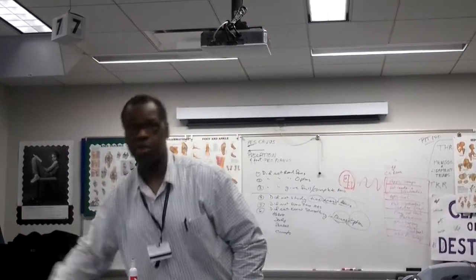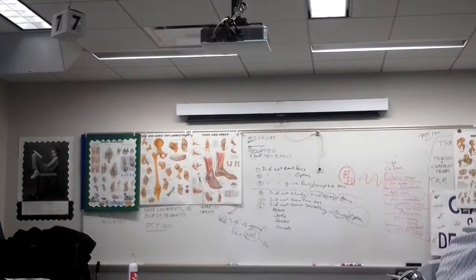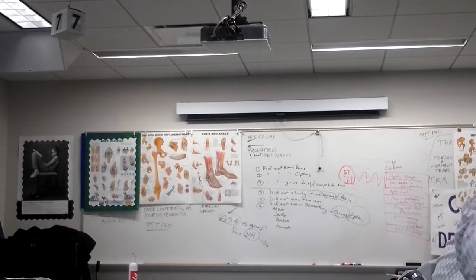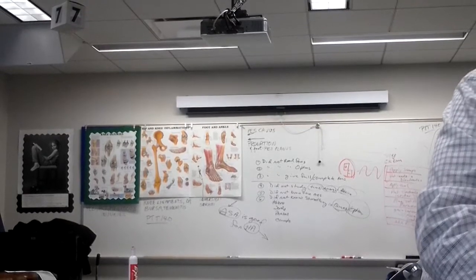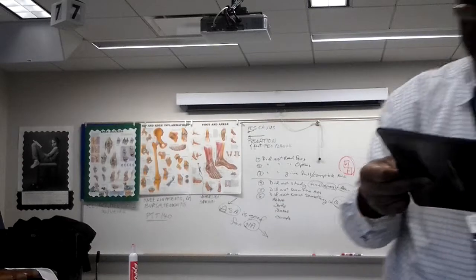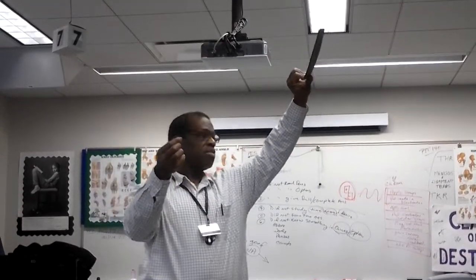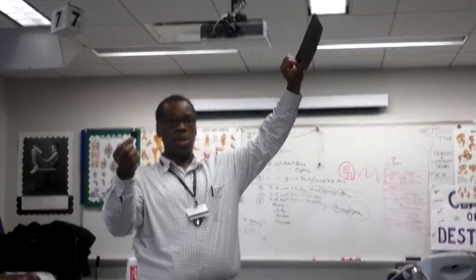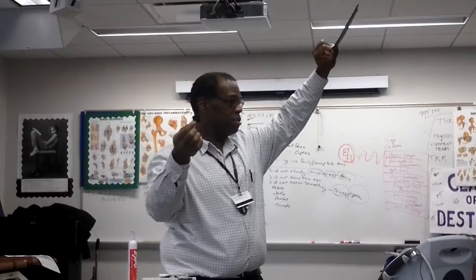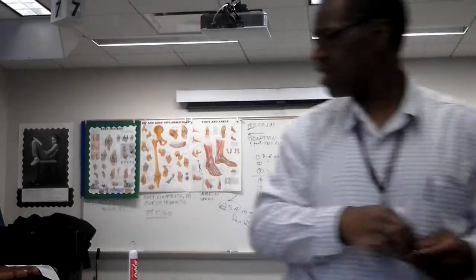Do they need to be equal size? No. I just need two pads on the same channel. I don't care what size they are. I can have a little teeny weeny thing there. Same channel. Do I have a circuit? Yes, I sure do.